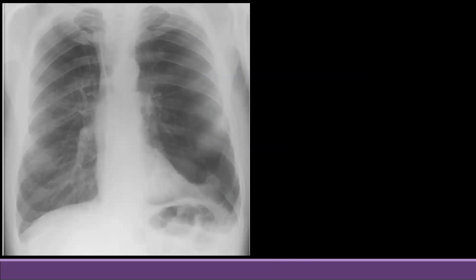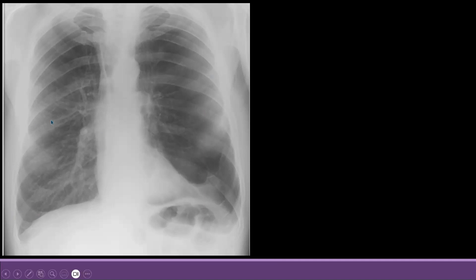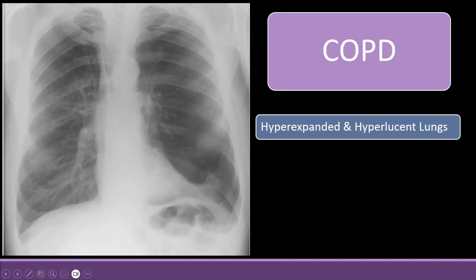Looking at this X-ray, this is a typical X-ray of COPD. The lungs in a COPD X-ray appear bigger and blacker compared to normal — they are hyper-expanded, meaning larger than normal. To confirm hyperexpansion, you count the ribs: first, second, third, fourth, fifth, sixth, seventh — if more than seven ribs are visible above the diaphragm, that indicates hyperinflation.